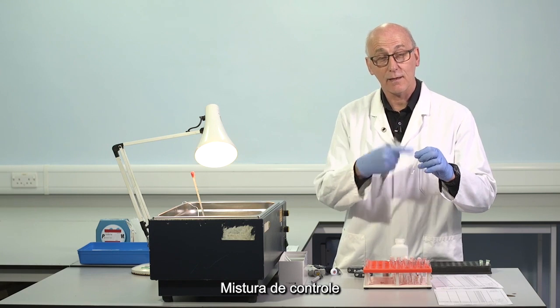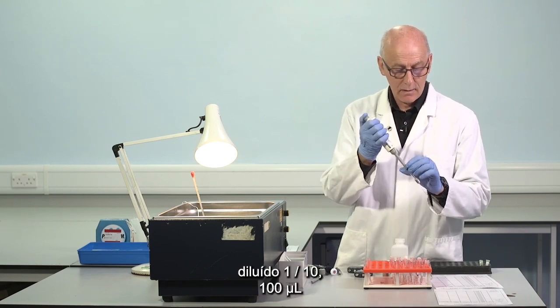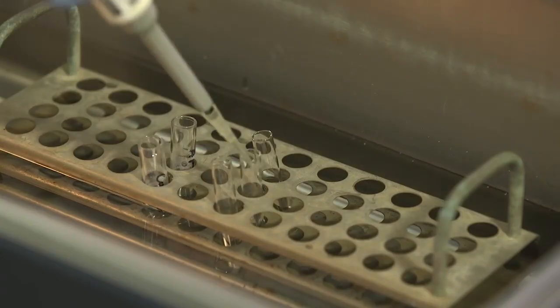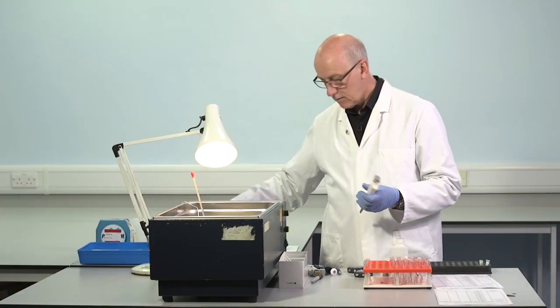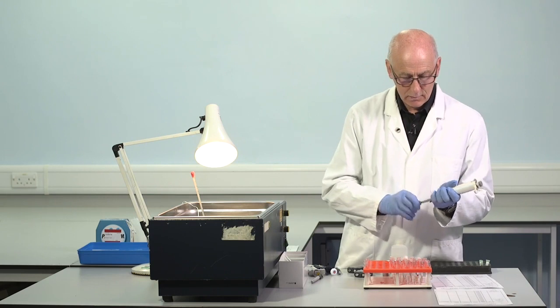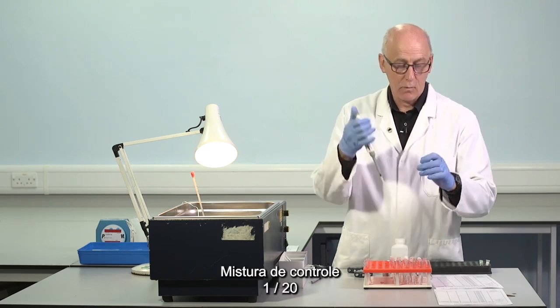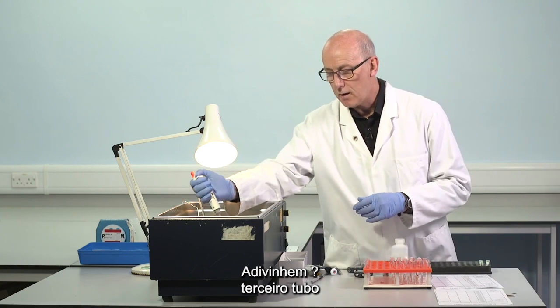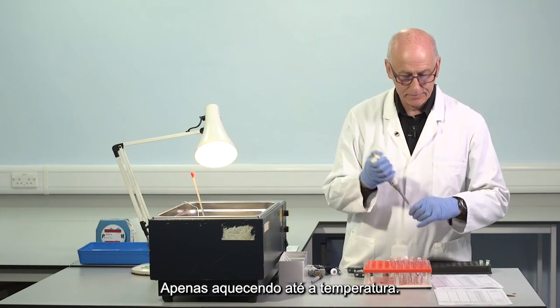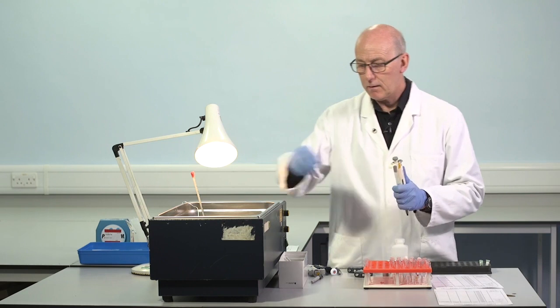Control mix, diluted 1 in 10, 100 microlitres, second tube. Control mix, 1 in 20, guess what, third tube. Just warming up to temperature. And mix.